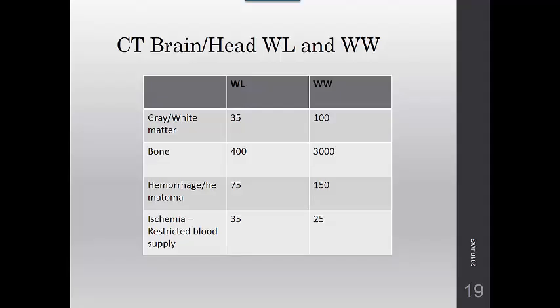So the first section gives us examples of clinical indications of the exam. We talked about these. They include intracranial hemorrhage, hydrocephalus, trauma, etc. AP and lateral scouts are recommended in this protocol, but usually only a lateral scout is needed.